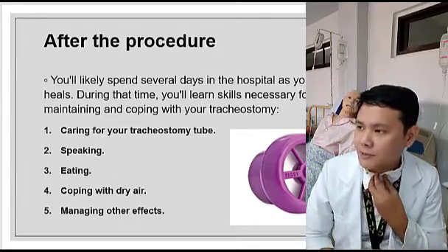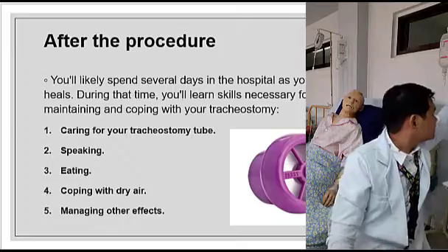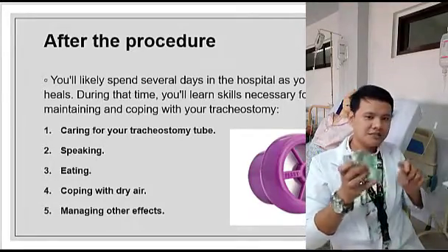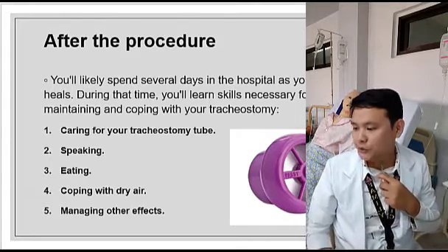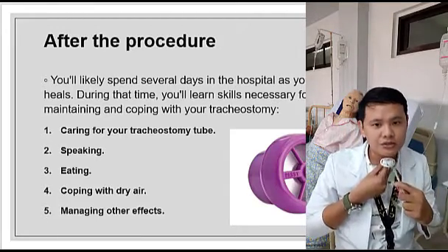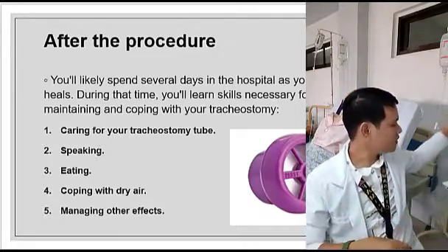Okay, what else? The O2. Yes, this. Okay, we have here the oxygen. Okay, meron po tayong special na device kung saan yun po ay ico-connect doon sa may trachea. Tracheostomy. Okay? So there will be some humidification na mangyayari. Okay? What else?